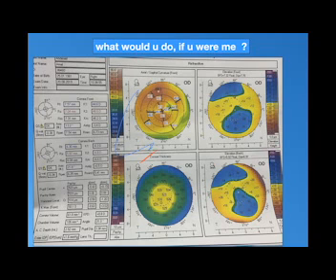I need to hear from you. Dr. Hossam, refraction and best corrected visual acuity. Very nice. Okay, the refraction is +3 sphere, minus 1.5 cylinder. The unaided visual acuity is 6/36. The best corrected is 6/9.